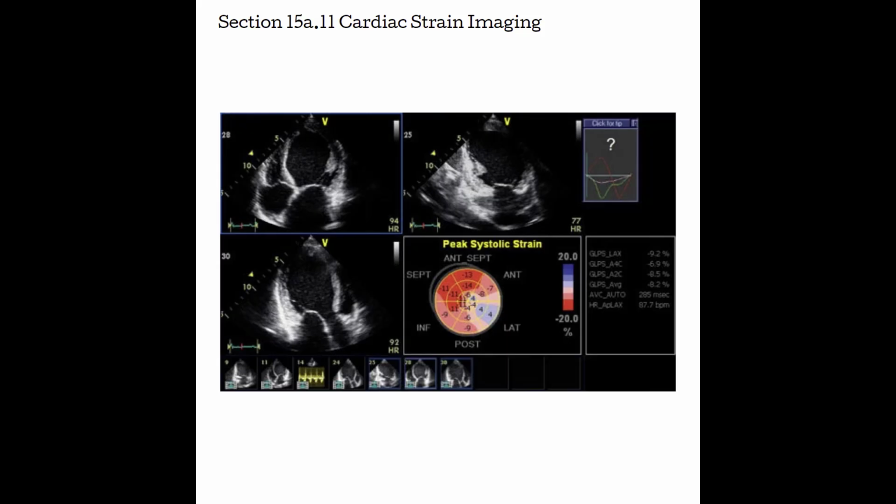Very similar to elastography, we have something called cardiac strain imaging. So elastography required outside force, like pushing or using those shear waves, to qualify the stiffness of the tissue. But since the heart is made of muscle and its responses to electrical impulses basically make it its own strain creator, the machine can measure the stiffness of the heart muscle as it contracts and relaxes. Something called the strain rate is going to show how effective the myocardium is at contracting.